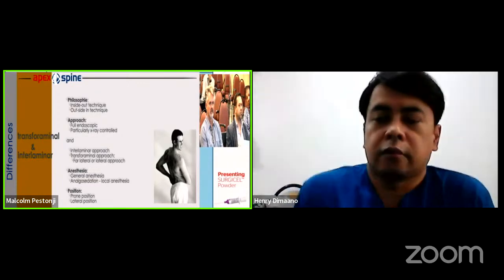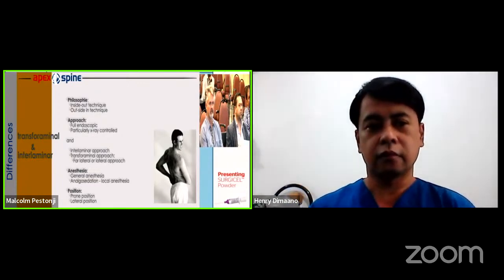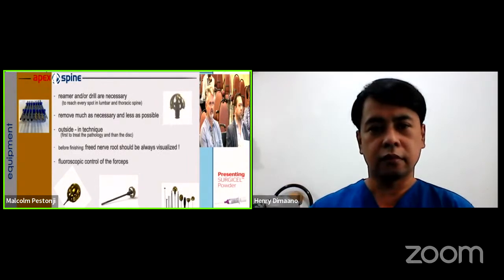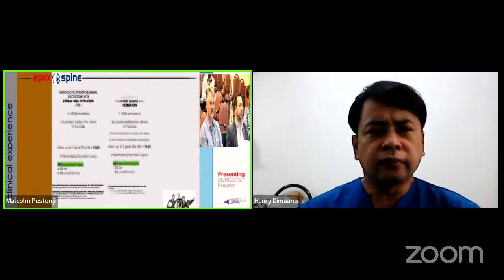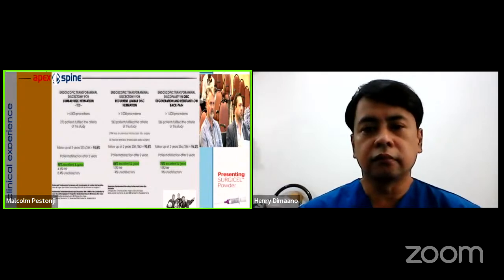You can perform it with the patient positioned in prone position or in lateral position. But nevertheless, for all these approaches, you will need a reamer or drill. You should remove as much as necessary and as little as possible, outside-in or inside-out technique, and you should always make a fluoroscopic control of your forceps. Here is some publication of me and my partners in the past.